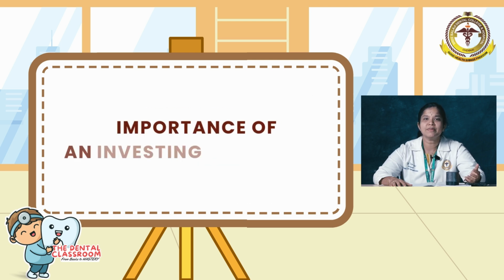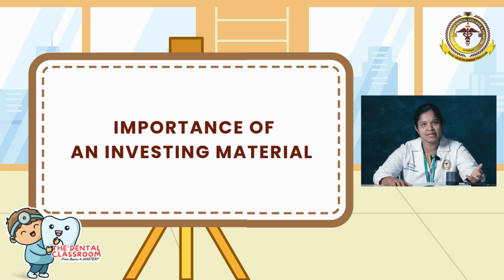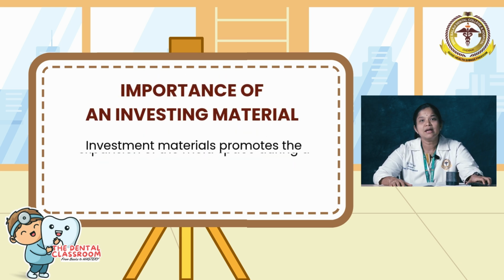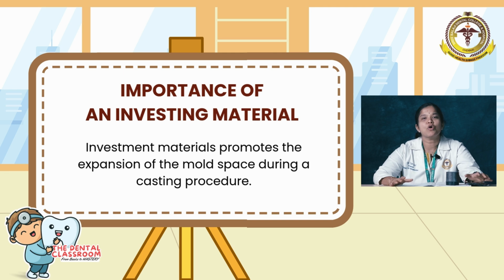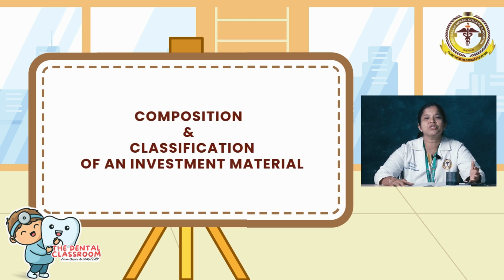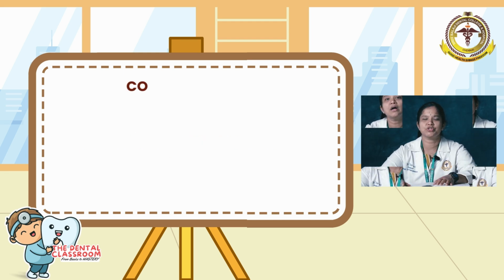So why must we know about this investment material? What is the importance of it? Investment material promotes expansion of the mold space during the casting procedure. What is the composition of this investment material? How do you classify investment material?